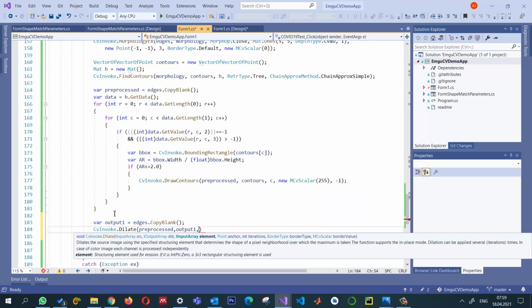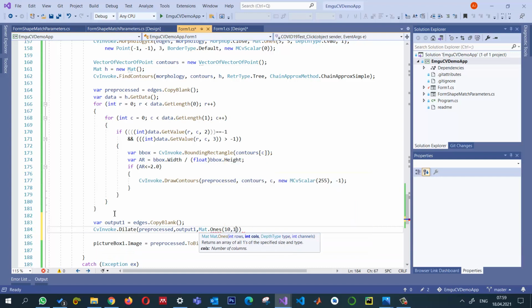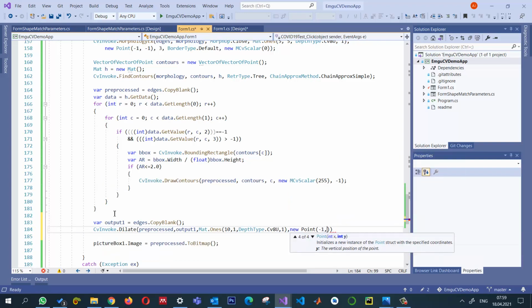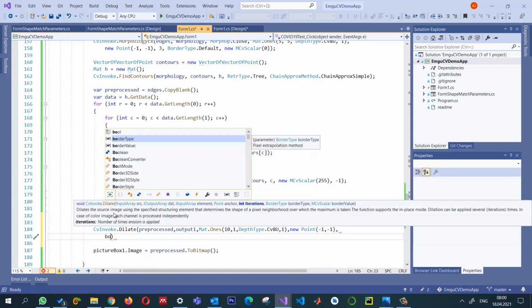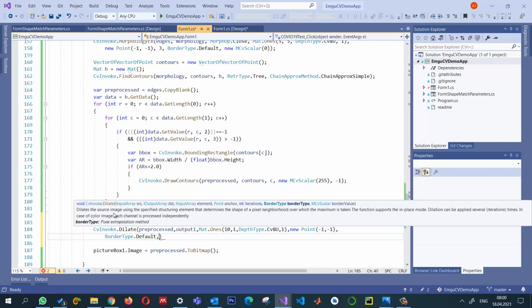Here I want to write it, and the structuring element that I want is Mat.Ones. So I need a structuring element with a large number of rows and only one column. The depth that we can give is an unsigned, and we need only one channel. Okay, and the next parameter is the anchor point, which will be -1 comma -1, indicating that it is the central pixel around which we are doing this dilation operation. And the border type that we want, that's the default, whatever the border is going to be.